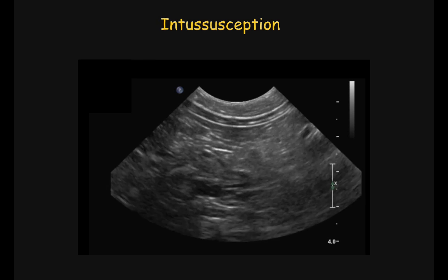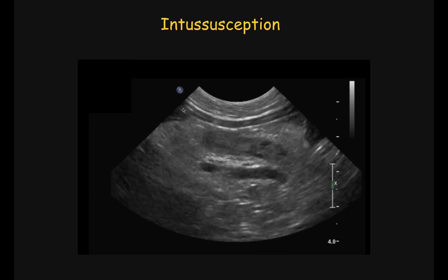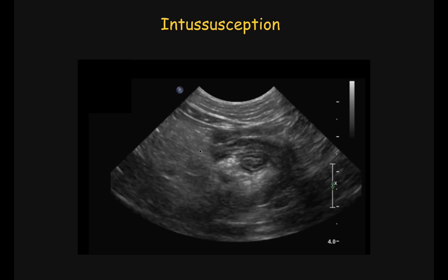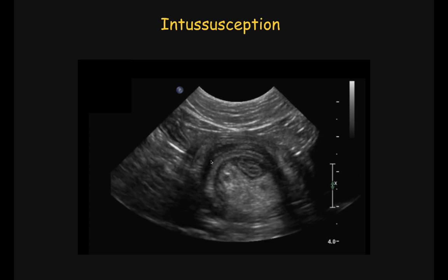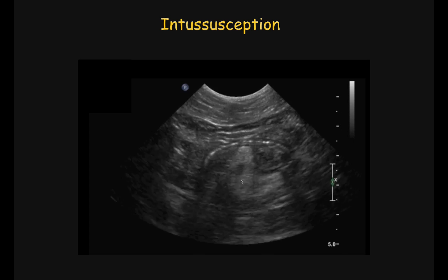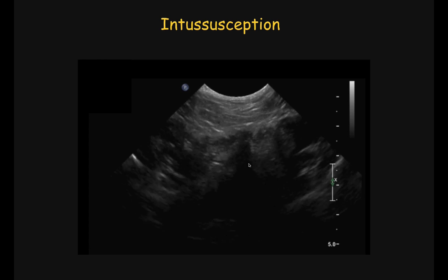In real-time evaluation of the intussusception in this dog, we see enlarged jejunal lymph node with some cystic-like component. And now we are approaching the intussusception with the invaginated fat, and we actually see part of the jejunal lymph node inside the intussusception.